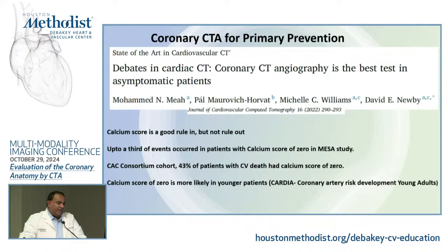And I know Dr. Nasser is not here, but it's the power of zero. We had that talk on rounds one day. Calcium score is a good rule-in, but not rule-out, especially in younger patients. I showed you the data from this year from Dr. Lipsick showing that patients less than 45 years of age are more likely to have non-calcified plaques. And these are some of the things that they talk about in their review.